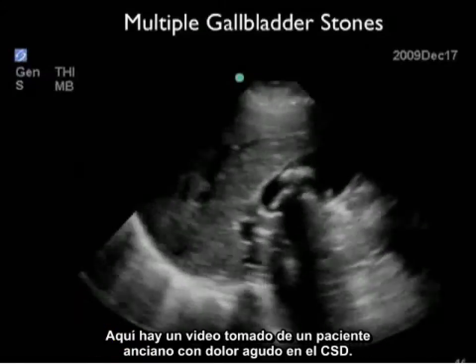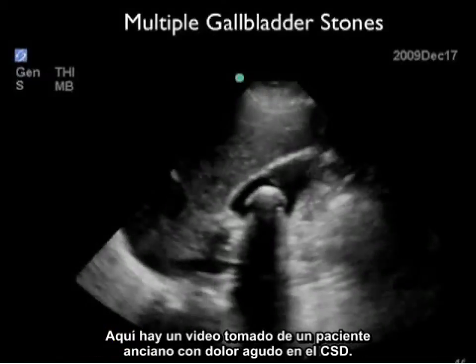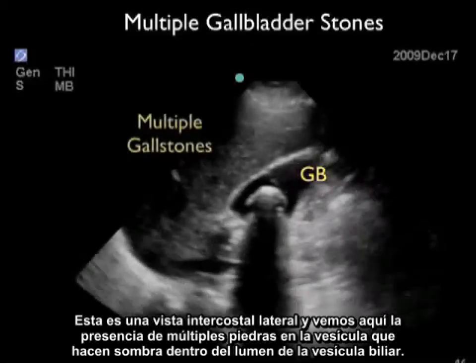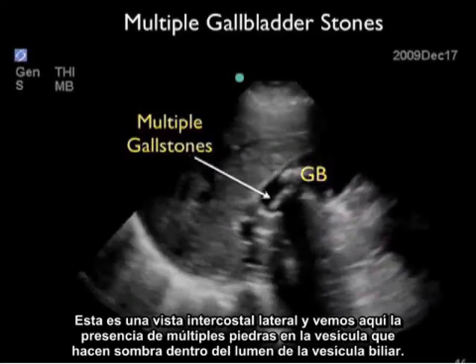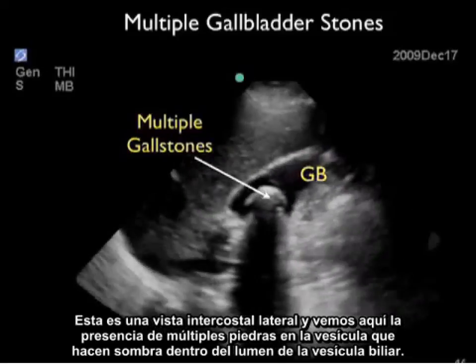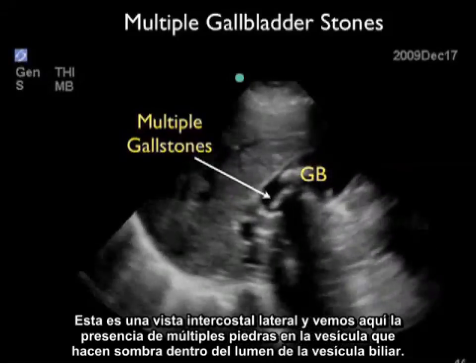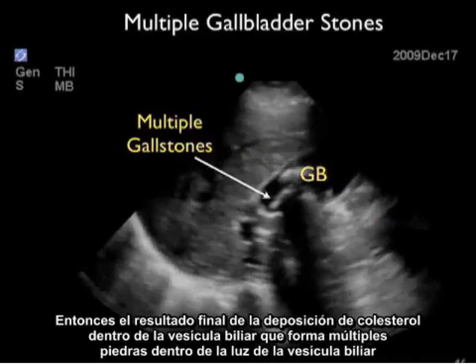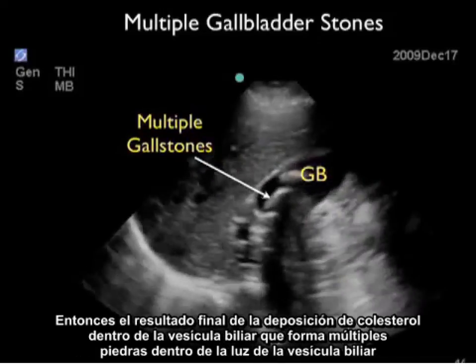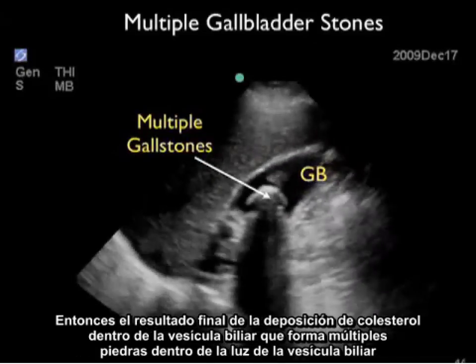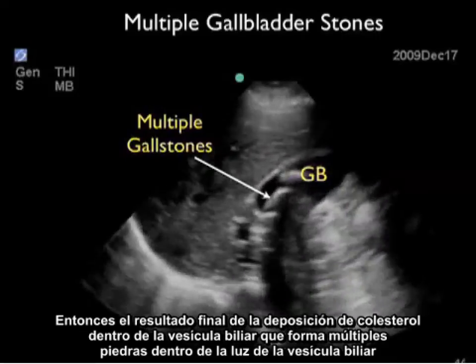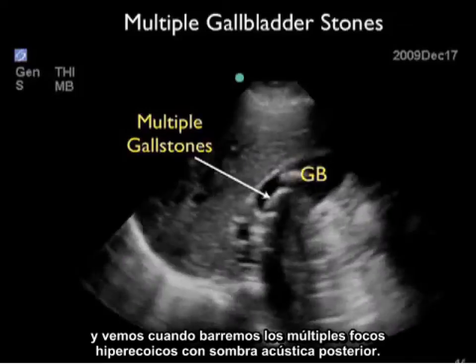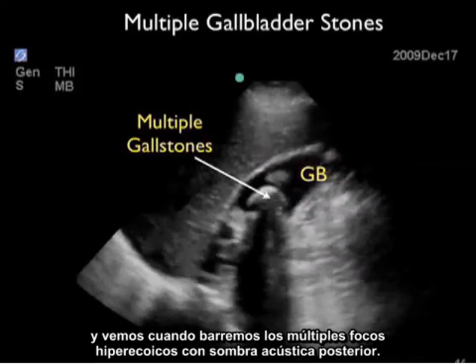Here's a video clip from an elderly patient with acute right upper quadrant pain. We're scanning back and forth through the gallbladder using the lateral intercostal view. We see the presence of multiple shadowing gallstones within the lumen of the gallbladder — the end result of cholesterol deposition forming multiple stones. As we scan back and forth, we see multiple hyperechoic foci with posterior acoustic shadows.